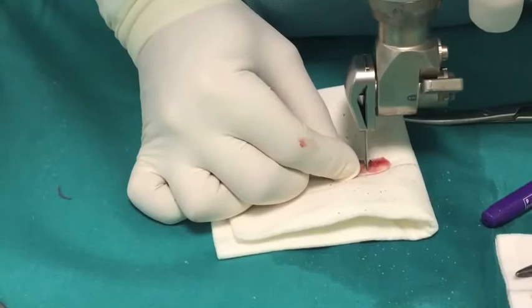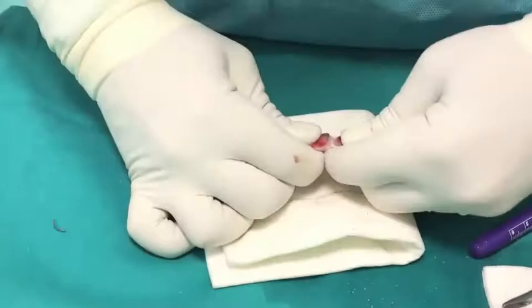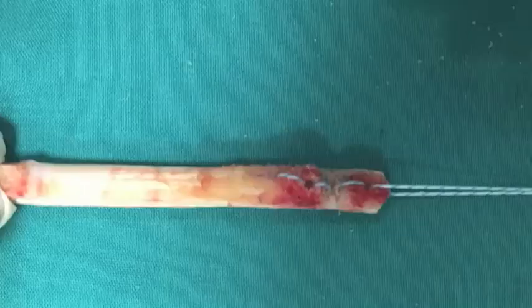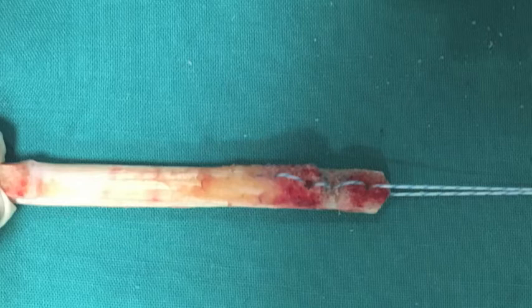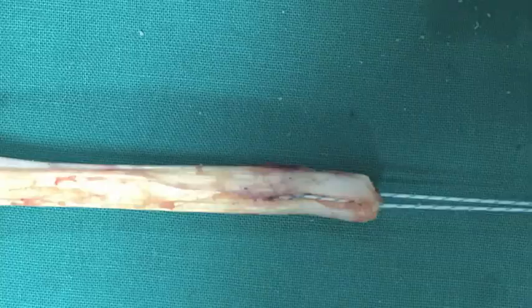A saw is first used to divide the femoral bone block into two equal sized parts and the final articulation of the bone block is made by hand. Then a drill hole is placed in each part of the separated bone block, and a non-absorbable suture is looped around the two holes and the tendon part, leaving a figure-of-eight-like configuration. This is the final appearance looking from the bone side and the tendon side.